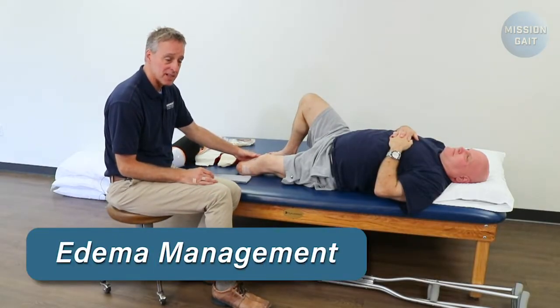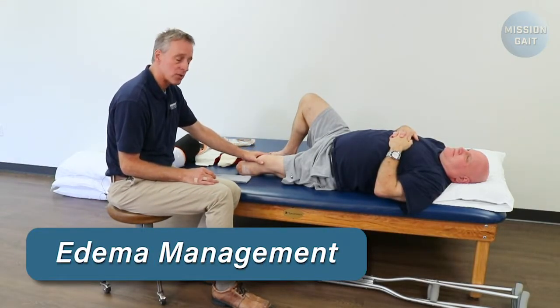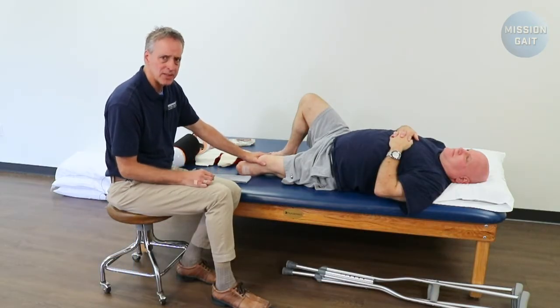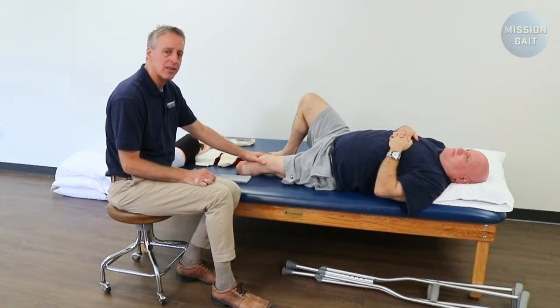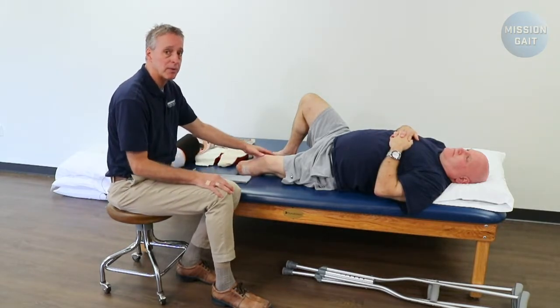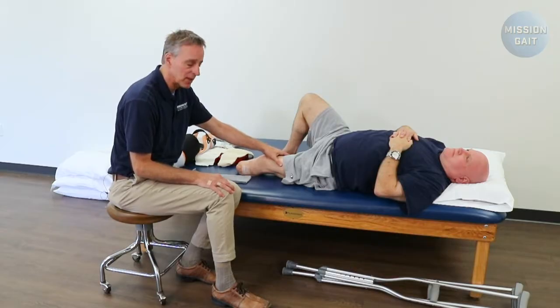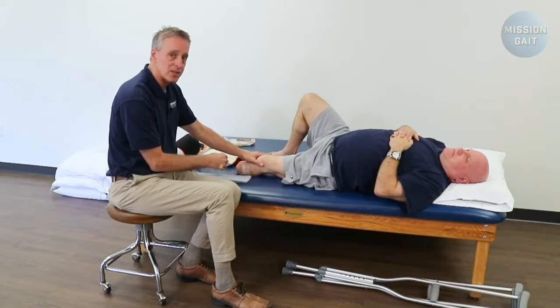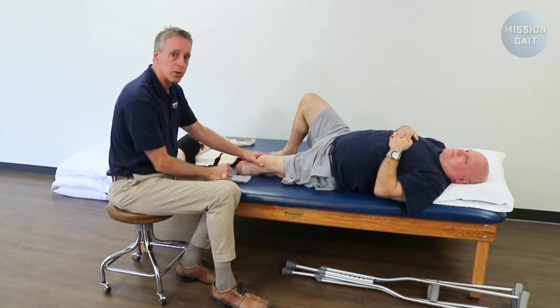When we're dealing with residual limb management, the process is trying to control the edema that's going to be in that residual limb. There are a couple of different ways to do that: rigid compression and soft compression. Rigid dressings work very well. Sometimes they're put on post-operatively. They can work well, but they demand constant follow-up because it's easy for the patient to start swelling and end up getting a wound.